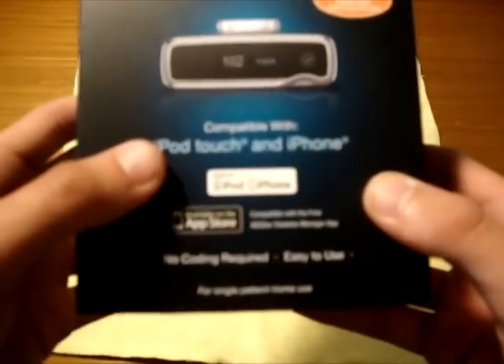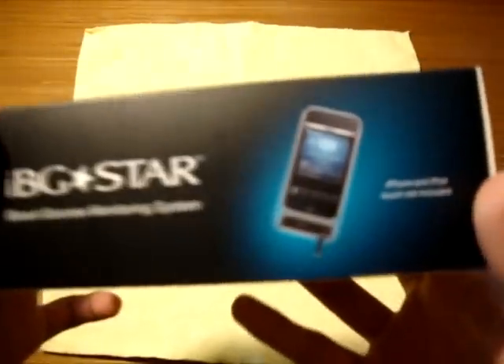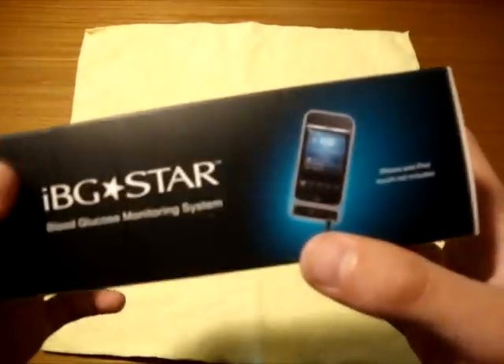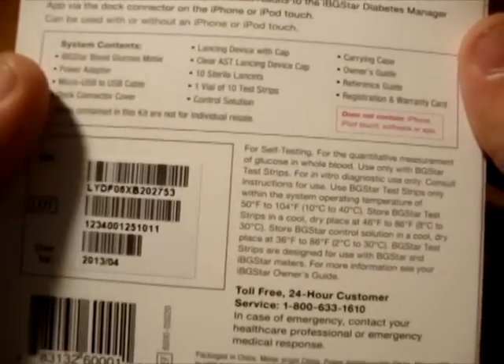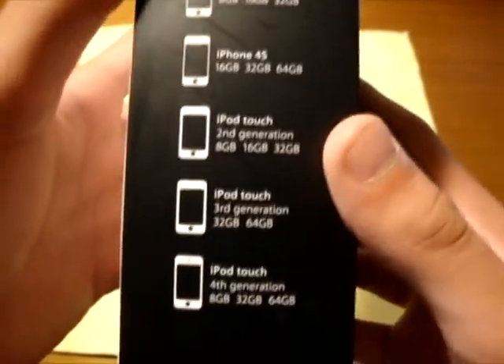There's an application in the App Store — I believe it's just called IBG Star — it's free, but you need this product for it to work. It also says 'no coding required.' Originally on other testers you needed to match up the code with your test strips — they don't have to do that here. On the back you've got all the little specs, everything that comes inside, pins, serial numbers, use-by dates, customer service info, and all the compatible devices.